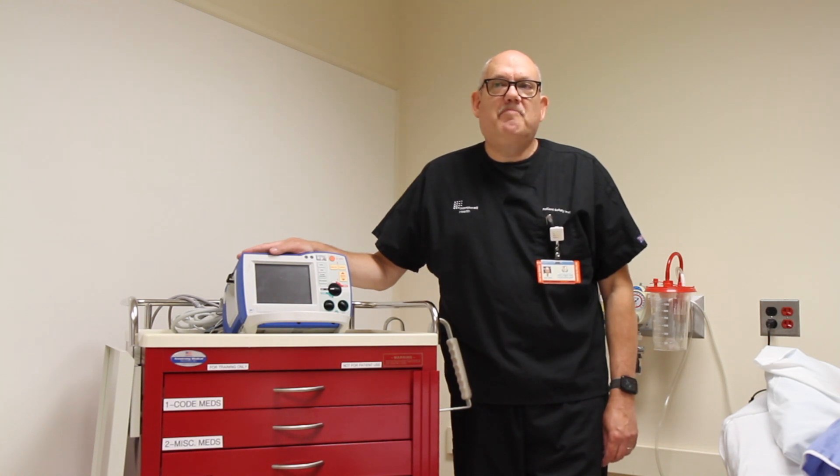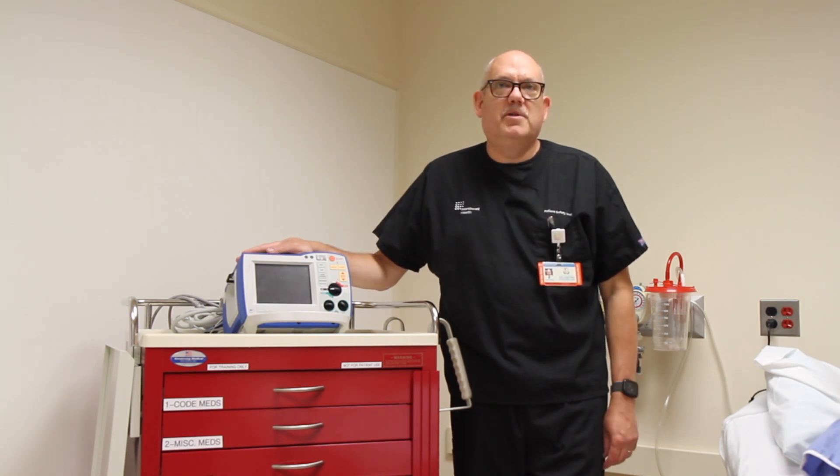Check that the hands-free pads will perform all three functions. If they do not, you may need to attach the limb leads for cardioversion and pacing. In these video modules, you will see us connect the cables to metal pins on the simulation mannequin. Your patients do not have metal pins, and you will follow the instructions on the hands-free pads and attach them to the patient's skin accordingly.